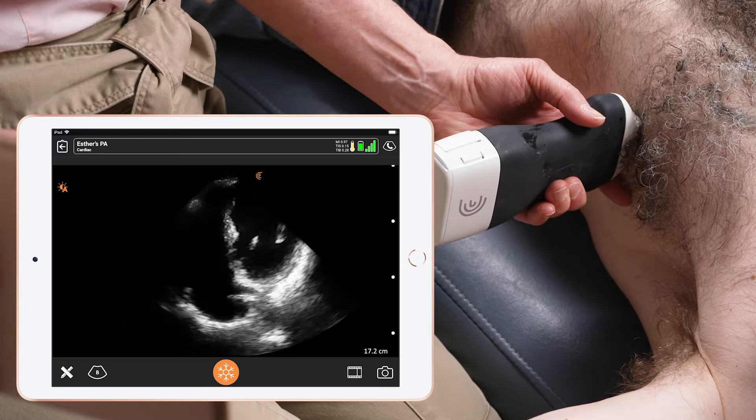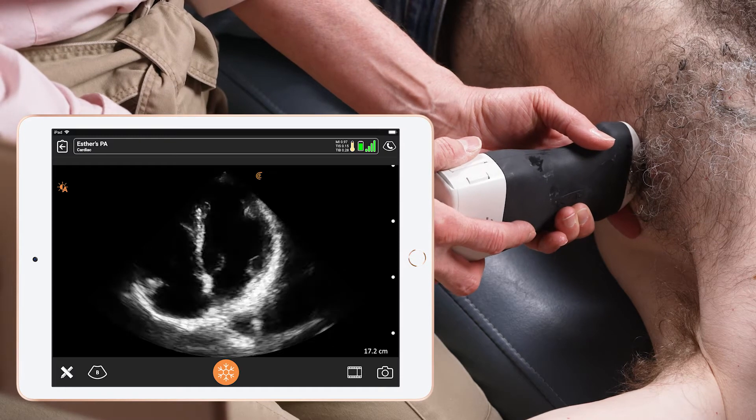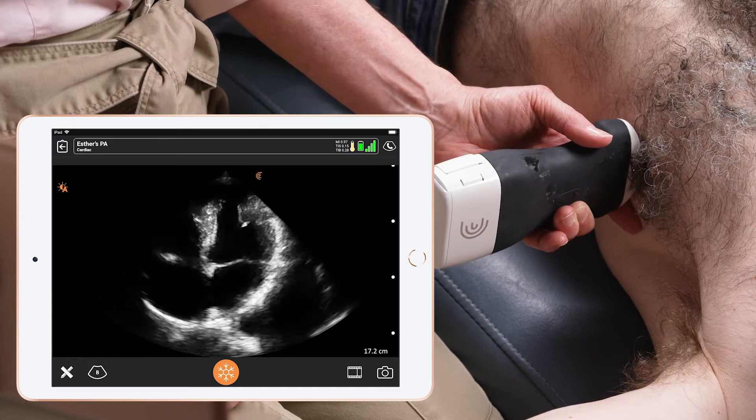I do that by moving between the ribs until I am able to elongate both of them fully. On the right hand of the screen is the left ventricle, and on the left hand of the screen you can see the right ventricle.